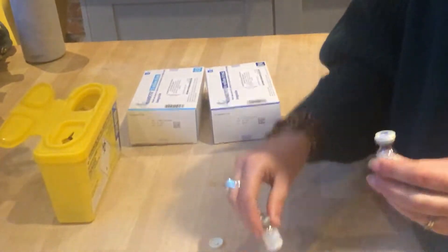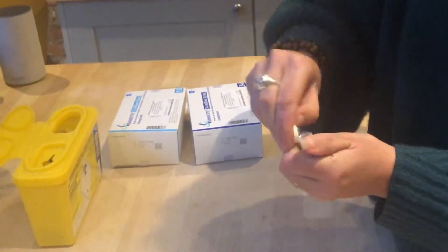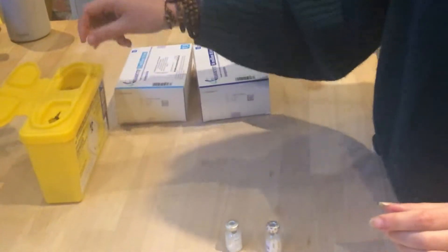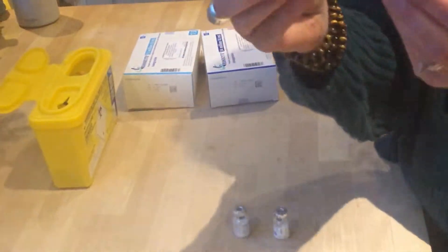So the first thing you want to do — these are the two powdered bottles of the units you want to mix. You want to take the lids off of everything. Always use your yellow box to discard of everything. And these are the two needles.